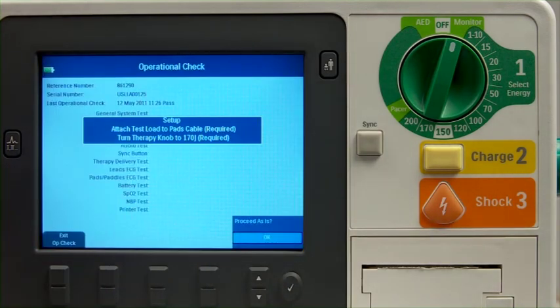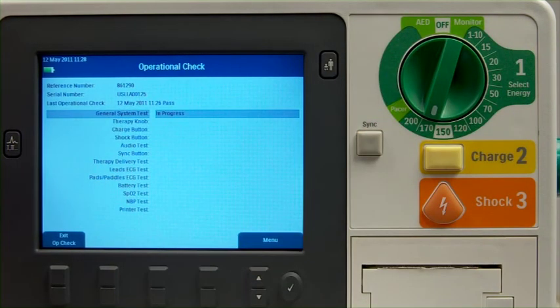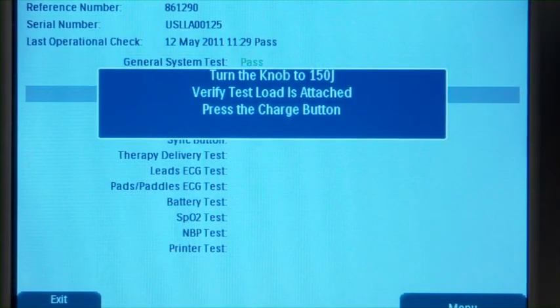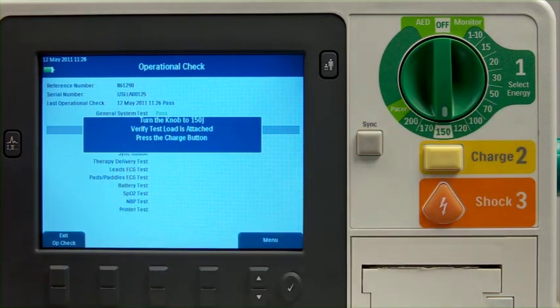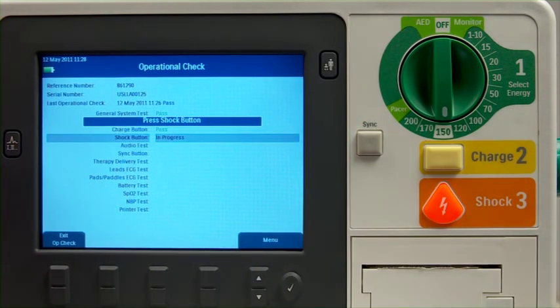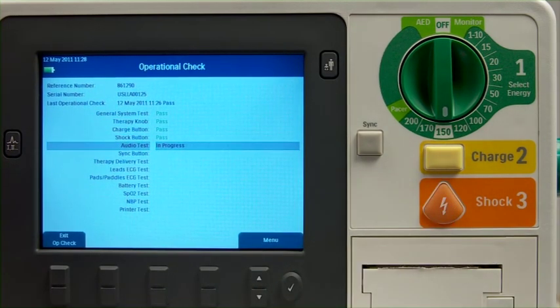Be sure to connect all cables and accessories as instructed on the display prior to running the operational check. You will be prompted to set the therapy knob to 170 joules, and then 150 joules. If everything is set up as expected, the series of tests will begin with a few interactions along the way. If not, you will be prompted to correct the setup, proceed with a test based on the current setup, or exit Op Check.